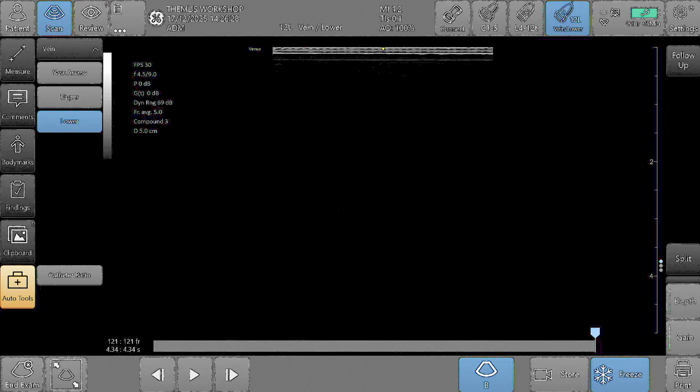Because positive ventilation has its greatest impact on the transthoracic part. But right now we are analyzing the distal part, the gut, liver, and renal flow, right? It's a reflection of the right atrium pressure. Actually, we use that to evaluate the patient's right atrium pressure. If you have invasive parameters like a Swan-Ganz, if you get direct information of the right atrium pressure, actually maybe you don't need to do the VExUS, right?